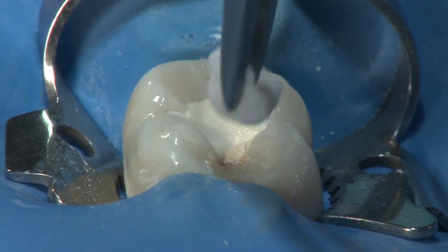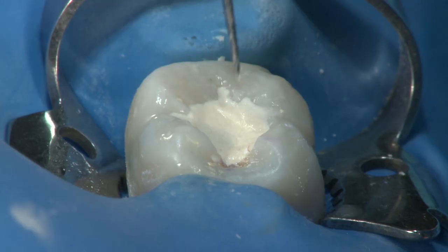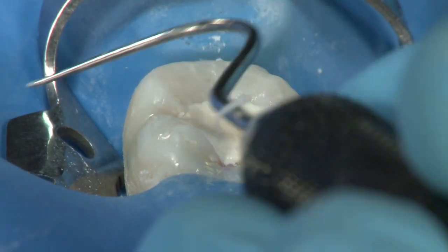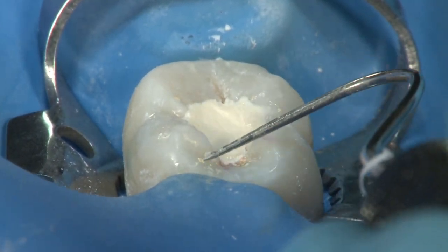Throughout this procedure, we've demonstrated how effective minimally invasive endodontics can be performed in a safe but efficient manner. By using the natural anatomy of the tooth as a guide, dentin is preserved, thus maintaining the strength of the natural tooth.